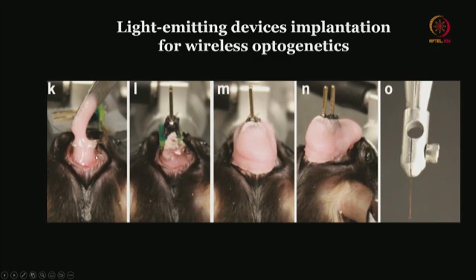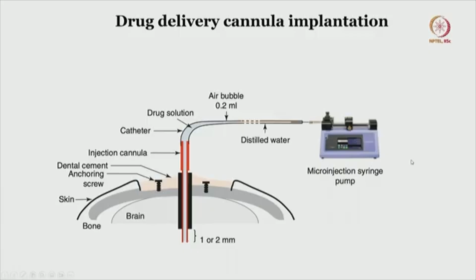So the dental acrylic goes around the implant and then occupies the entire area of the screws, and you can even further cover the entire implant with the acrylic, leaving the light emitting wireless electrode outside the implant for electrical communication, and that is the picture of this particular adapter holding the device. So that is about the various devices and implantation.